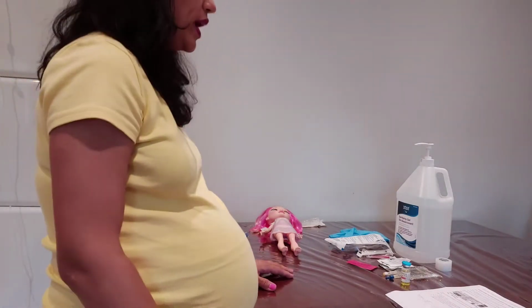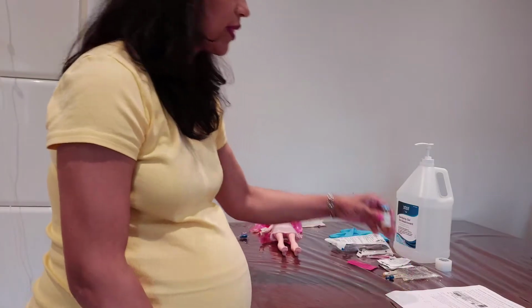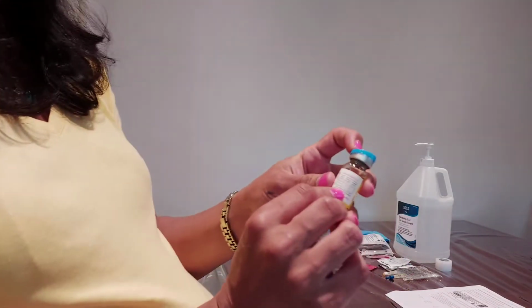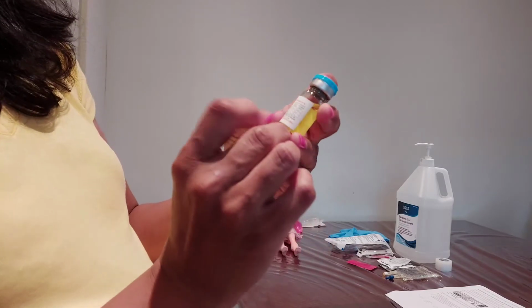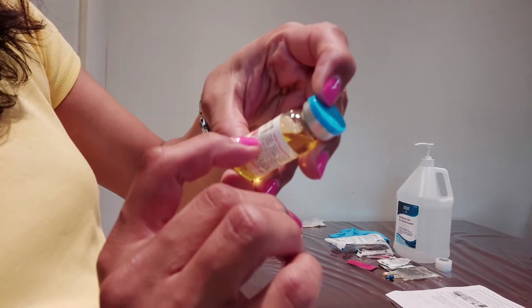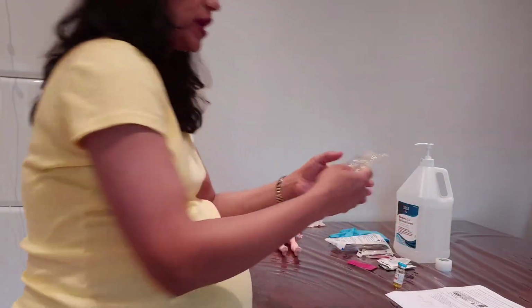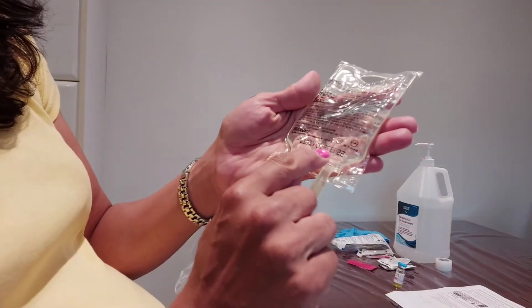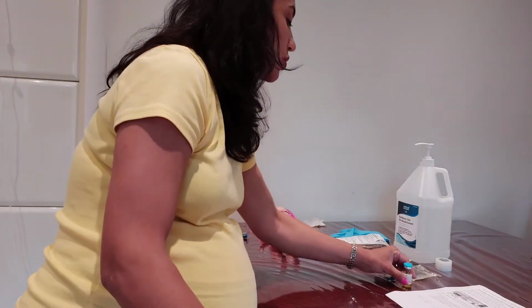Second, I will check the medication. The medication is pantoprazole 40 milligrams, and the expiry date is November 2021. Second, I need to check the mini bag for the expiry date also. It's February 2022.